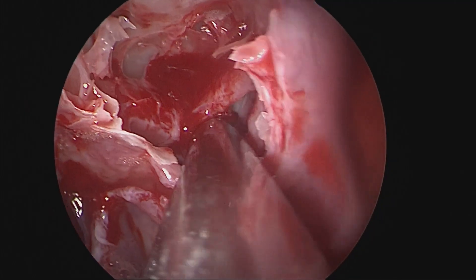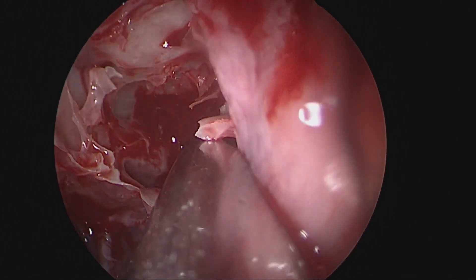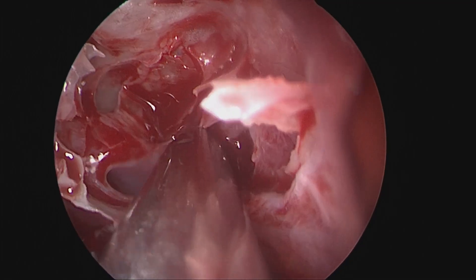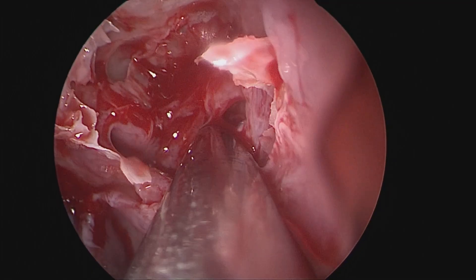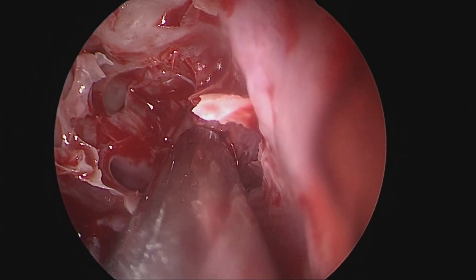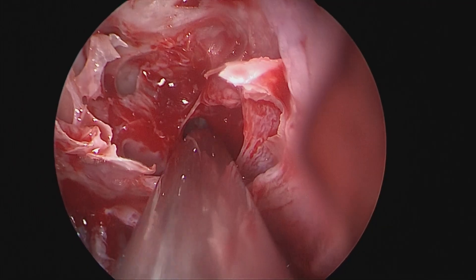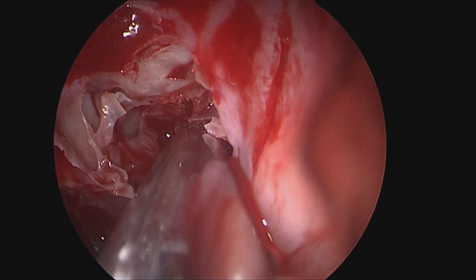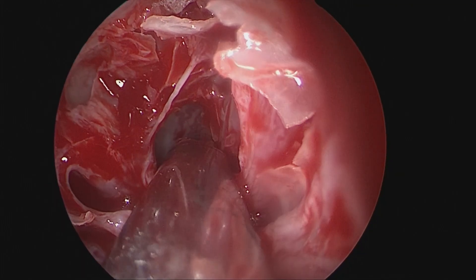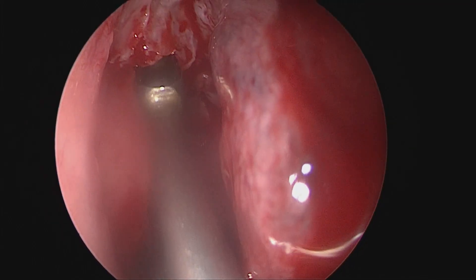Posteriorly, this is the superior turbinate. As we go medial to the superior turbinate we encounter the sphenoid sinus and the sphenoid ostium. The sphenoid sinus happens to be the lowest-most point of the skull base, so it is very important to identify that. We resect the inferior third or half of the superior turbinate depending on the extent of disease to open the sphenoid sinus, and we start getting a glimpse inside, using either a shaver blade or a thick bone punch depending on the thickness of the anterior face of the sphenoid.